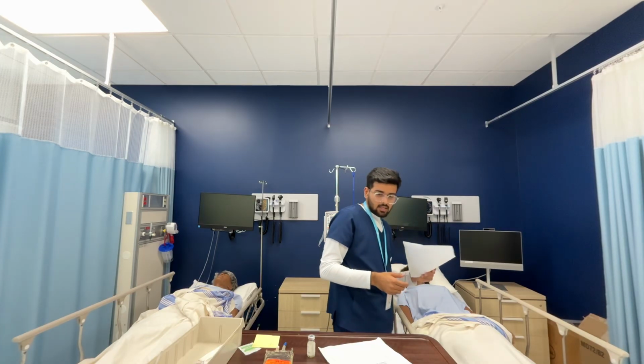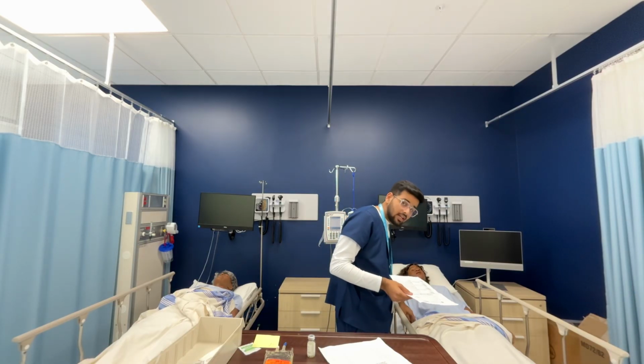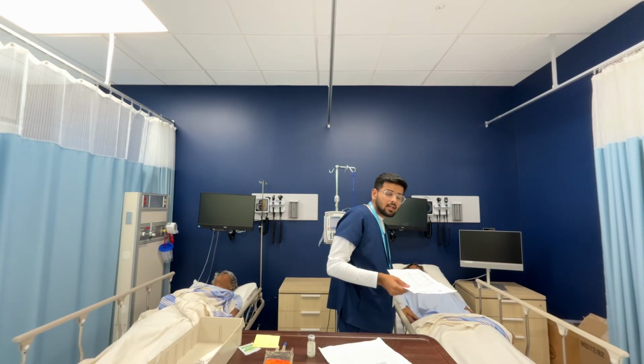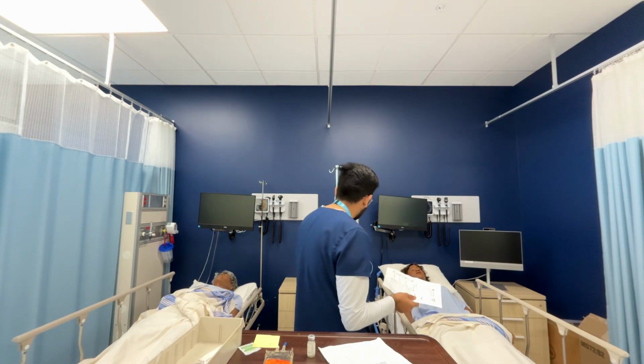Is it okay with you? She said yes. I got her consent. Before I leave, I've already checked her IV site. Her IV site is well intact, connected. There is no leakage, and there is no bubble as well in the tubing.